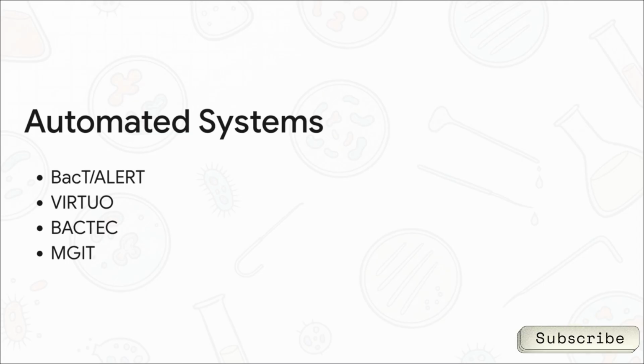For your practicals, you have to know how they work. BacT/Alert systems are colorimetric. They detect the carbon dioxide produced by multiplying bacteria, which physically changes a sensor's color from blue-green to yellow. BACTEC, on the other hand, is fluorometric.